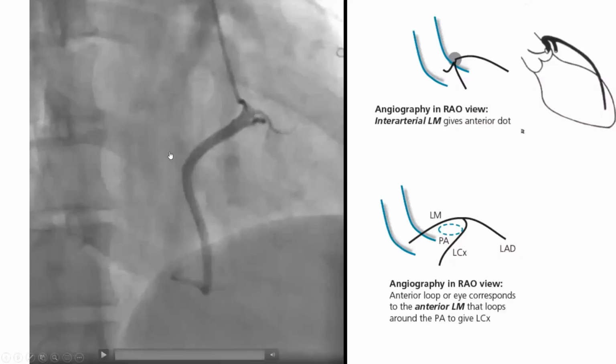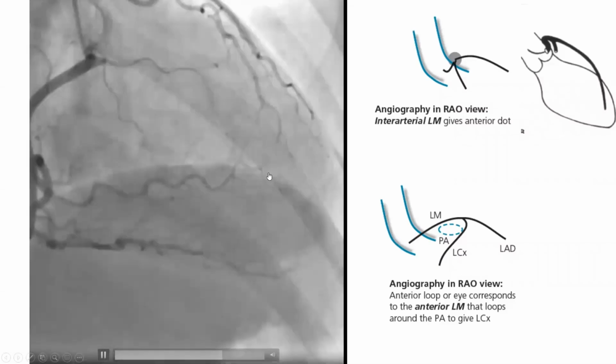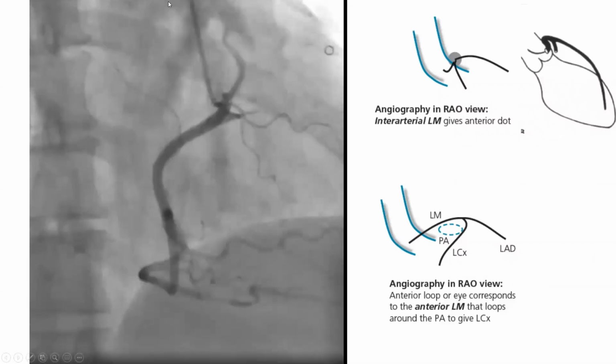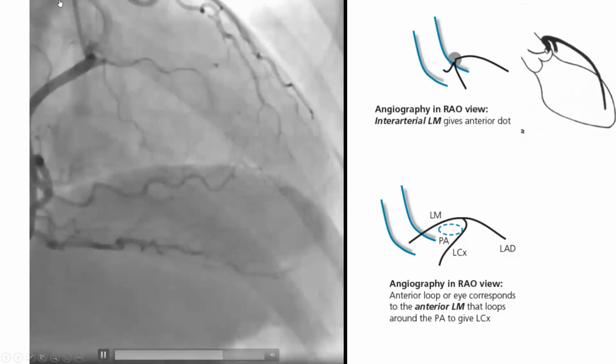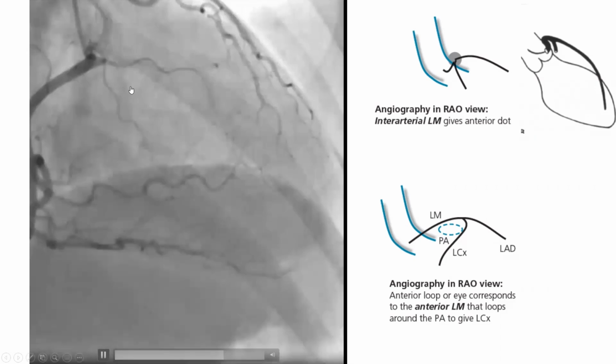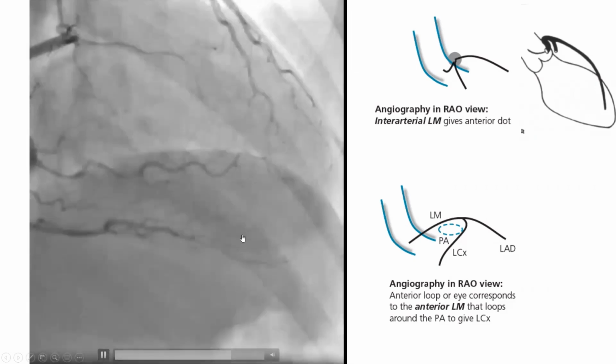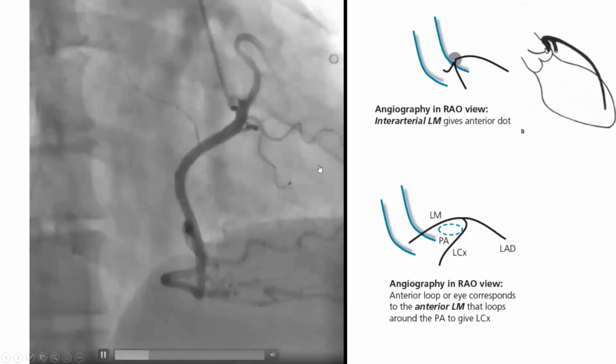So this is an interarterial course. I hope everybody understood that. Look, again, you can put a Swan catheter to confirm. You can do a full aortic angiography to further delineate the aortic boundaries and help. So full aortic angiography, Swan, and sometimes to aid, you can add a left lateral view.